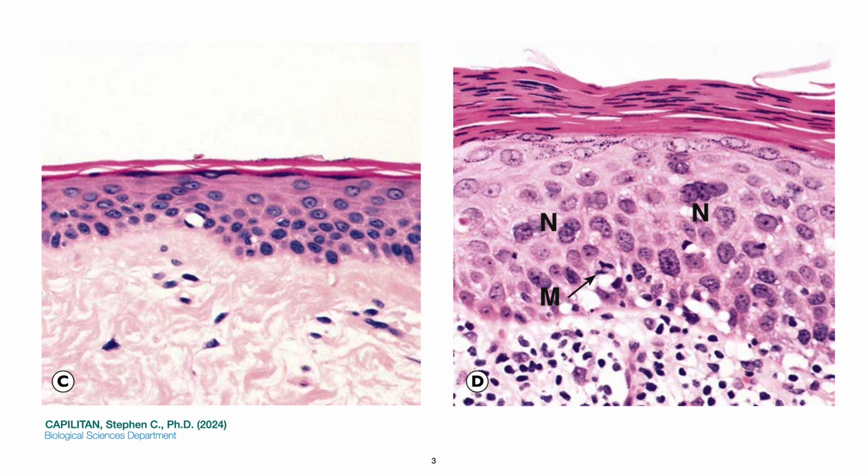Letters C and D demonstrate similar features in normal and dysplastic skin, respectively. Note that the normal cell stratification is disrupted in the dysplastic specimen by cells with large, darkly staining nuclei and multinucleated cells in letter N, extending into the middle strata. In addition, a disturbed pattern of maturation also is reflected in the development of a thick layer of keratin which contains purple-stained nuclear remnants, or parakeratosis. It is this keratin layer that becomes clinically evident as thickening and scaling of the skin. Mitotic figures are also apparent above the basal layers.